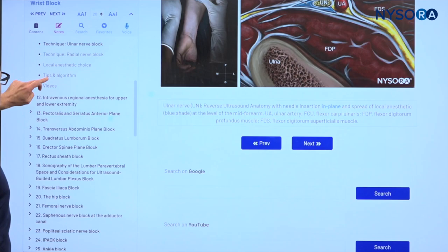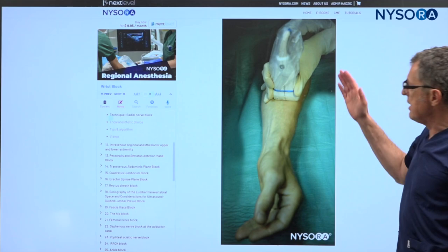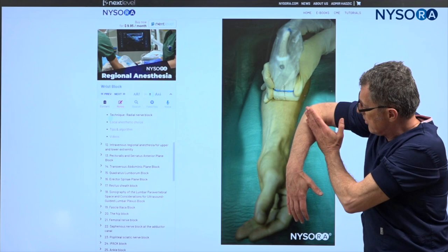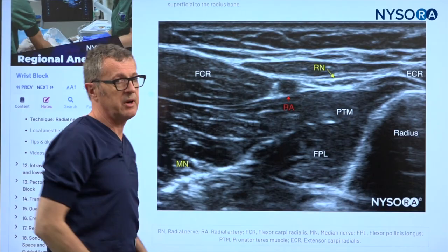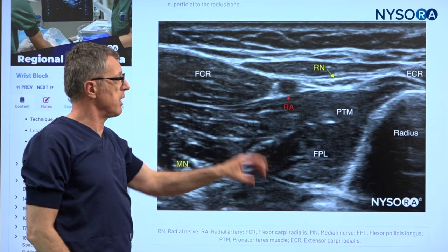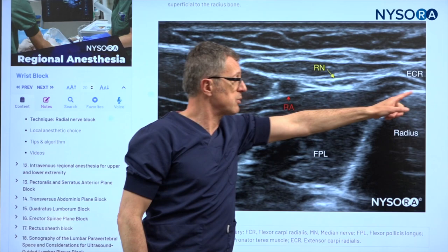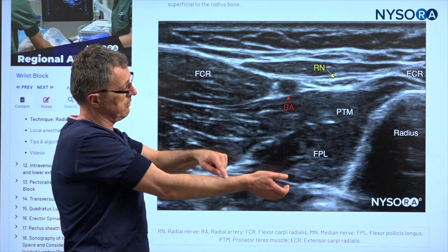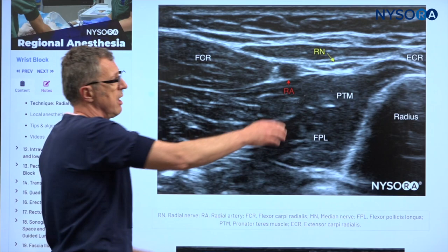What we're left to do now is the radial nerve. Going to that section on Next Level NYSORA, here we can see the probe has been moved to the lateral side of the forearm. We can find the superficial radial nerve anywhere alongside this axis. This is the ultrasound image we're trying to obtain — that's the radial artery and the radial nerve lateral to it, and the radius bone. We can see how the radial artery, radial nerve, and the radius bone relate to each other.